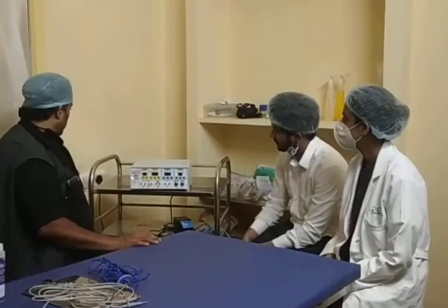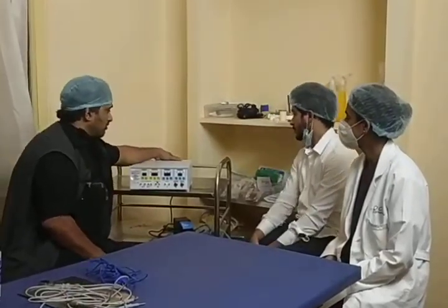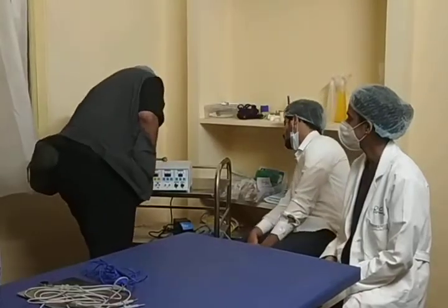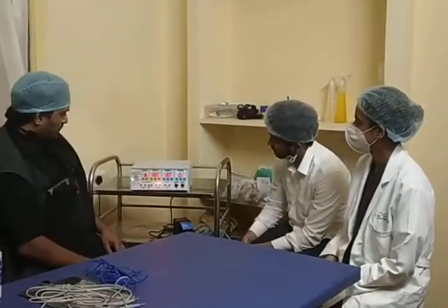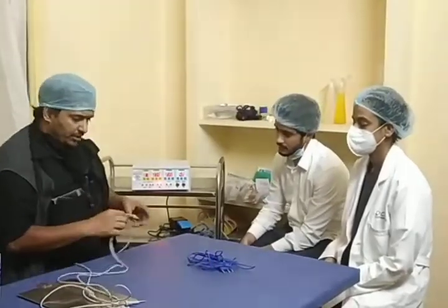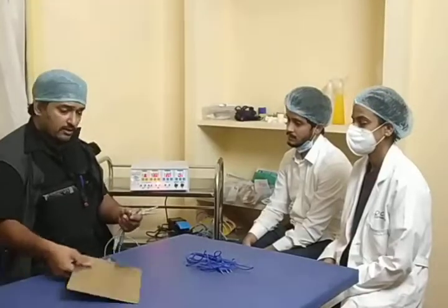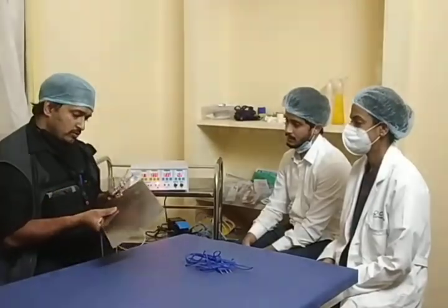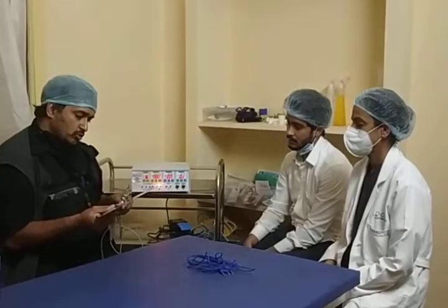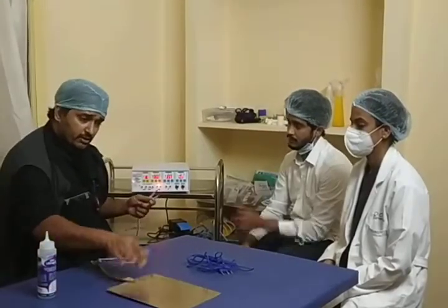So, there is a power switch over here, 5 ampere plug. There is a switch over here on back. Once I switch it on, we'll have a power supply over here. The most important thing that you need to understand is the cautery unit needs an earthing. So, this is an earthing cable over here. This is a metal earthing, so you need to use either ultrasound gel or a wet cloth or a mop over here. It has to be under the patient.